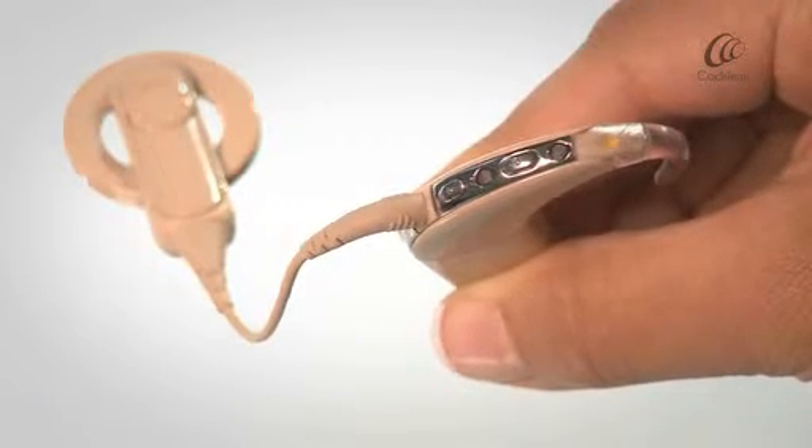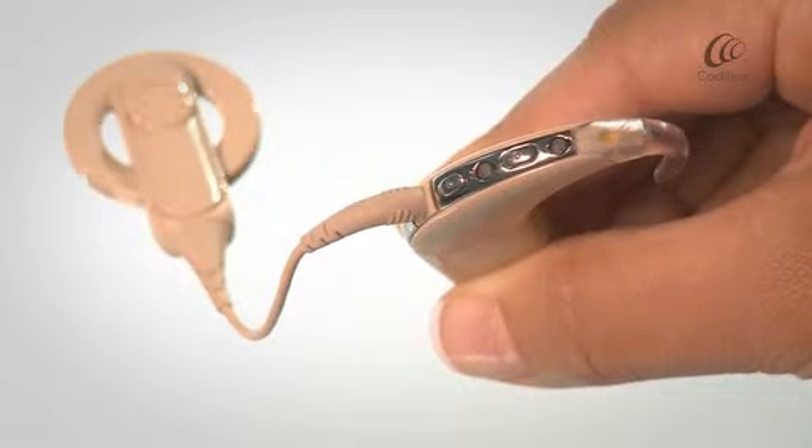When your processor is not attached to your implant, the LED light will flash orange.